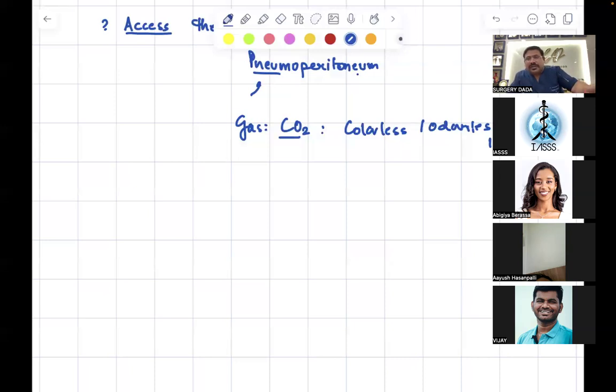So the moment you use the diathermy, the moment you press on the pedal, there will be a burn. And this is again chaos. So CO2 has to be used. In case you finish the CO2, nowadays room air can be used. The new insufflators have an emergency backup that will convert the intraoperative OT room air into the standard insufflation mode. So there is a backup. If you finish off the CO2, yes, you can use the standard room air for that, but not oxygen and not the classical nitrous oxide.